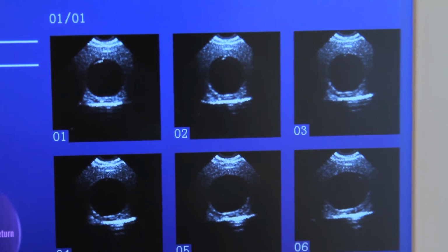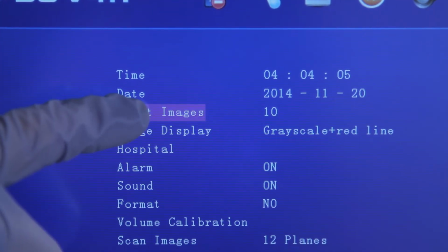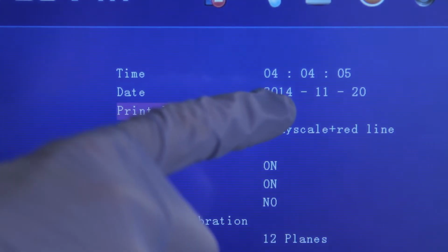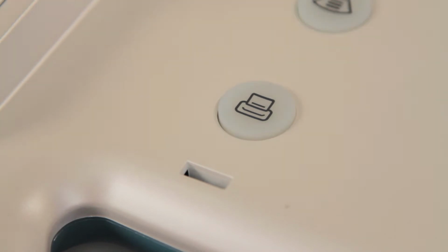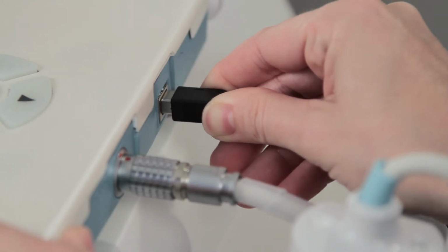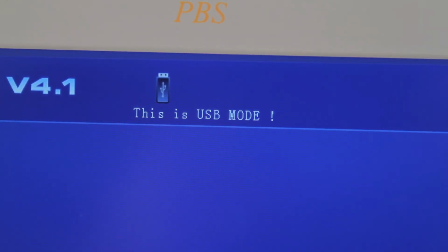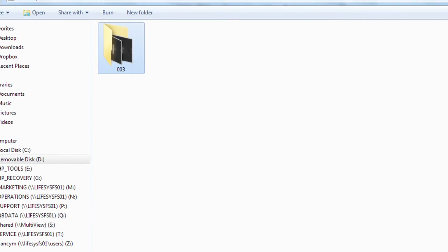Scanned results can be printed immediately after performing a scan or recalled from the device's memory if they were saved. The user may select how many images to print on the print page and hit the print button to print. You may export the historical data saved in the system to your PC using a USB connection. The system will also build a folder for each user. The same info in the folder should correspond with the patient's ID. Only grayscale images and a copy of saved readings will be saved in each folder.